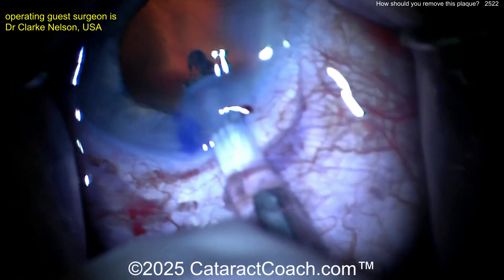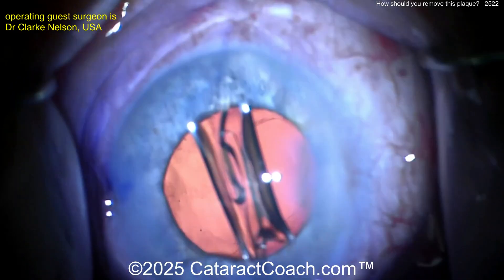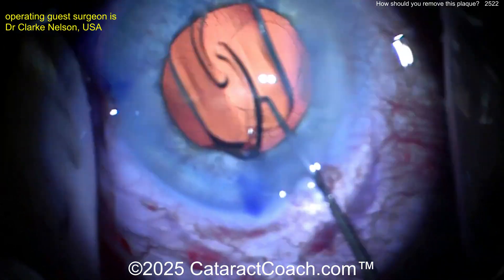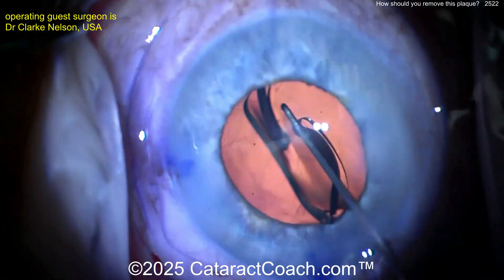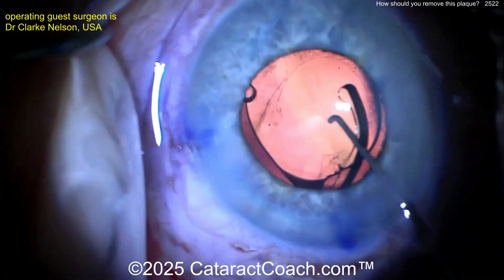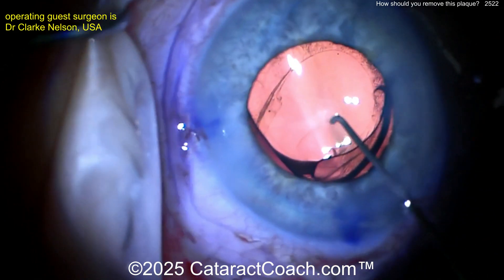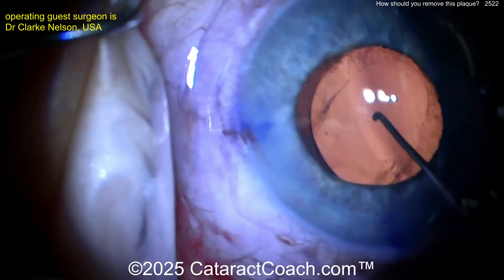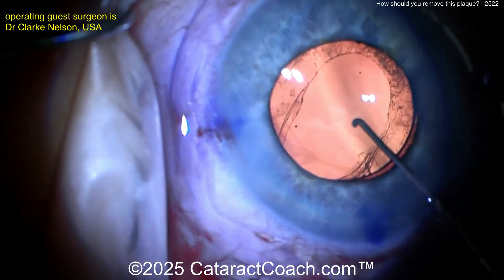But let's see what happens here. Here comes a single-piece acrylic lens going in the capsular bag — nice and easy. That's in the AC first. Let's get that delivered into the right position. Slowly tucking it in — I like the maneuvering there. Whoa, the capsule opened up more — look at it. Now the capsule's opening is much bigger. I like that the haptics are ninety degrees away from that opening.